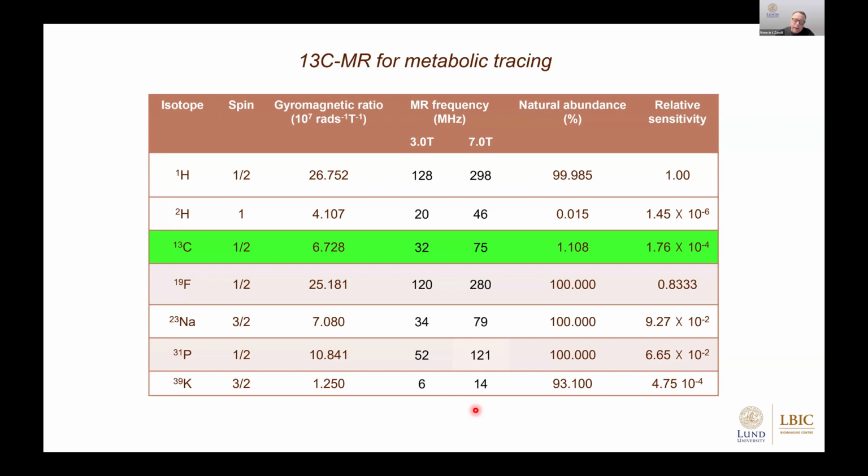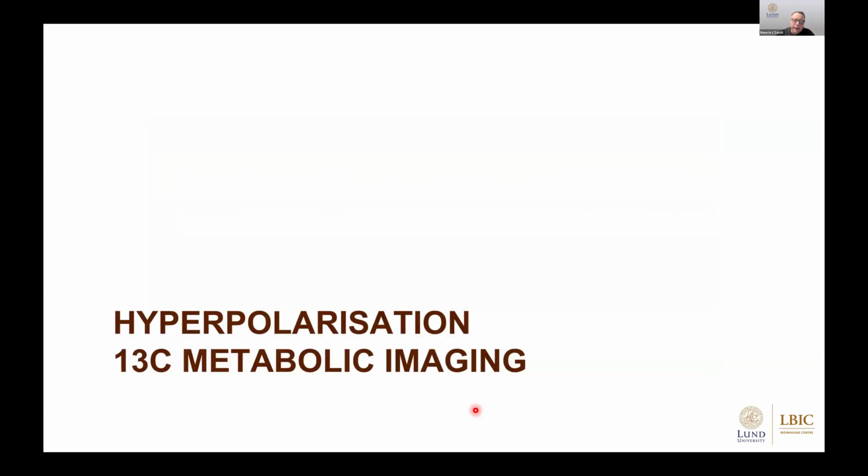So carbon-13 studies to visualize metabolism or general carbon, even carbon-14, are being used a lot. You have the carbon-11 variant in PET, so it's a very often used molecule to study metabolism. The trick here is the combination with hyperpolarization. So we use the carbon-13 technology that has been around for decades and add something to amplify the signal dramatically.